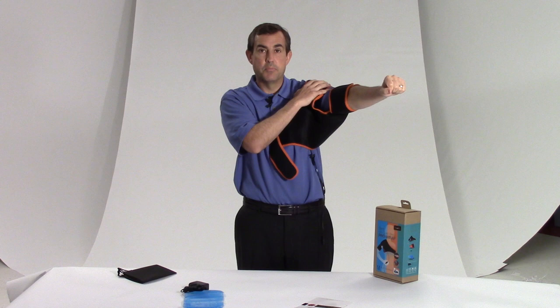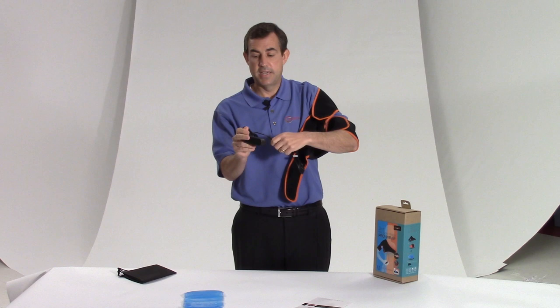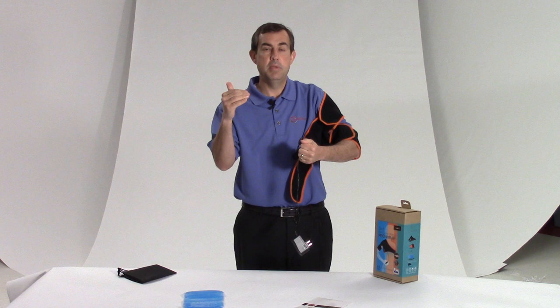Then I take the controller for the heat, attach that to my AC adapter and plug that into the wall — it has a nice long extension. I select one, two, or three, which is low, medium, or high. That's how you get that infrared therapy right on your shoulder.